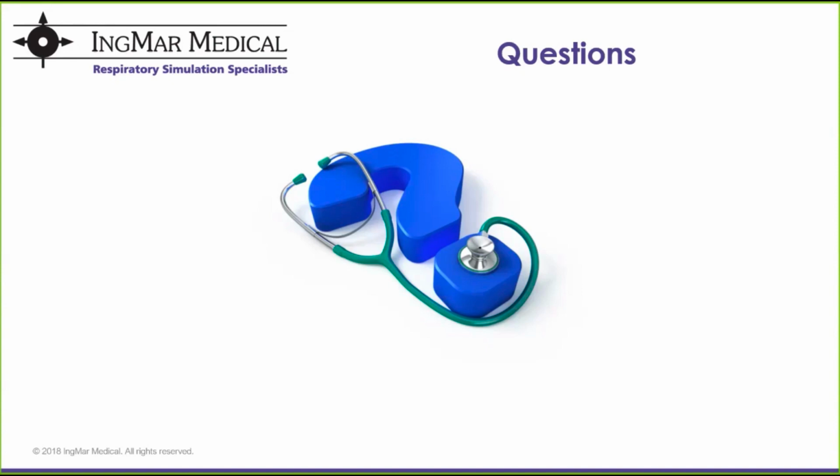So Jean-Paul asks, is it possible to simulate any kind of patient, including ARDS and COPD? Virtually any type of respiratory condition can be created, due to the fact that our range of settings that can be applied is very wide and almost limitless. So our resistance and compliance settings would represent any condition that you could imagine in terms of ARDS or COPD.